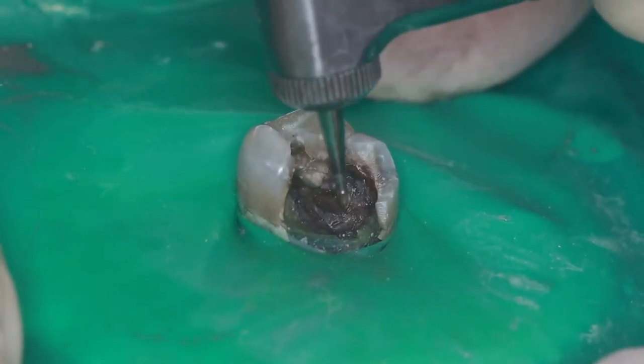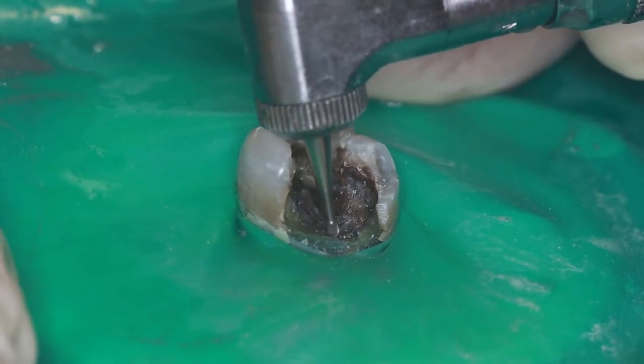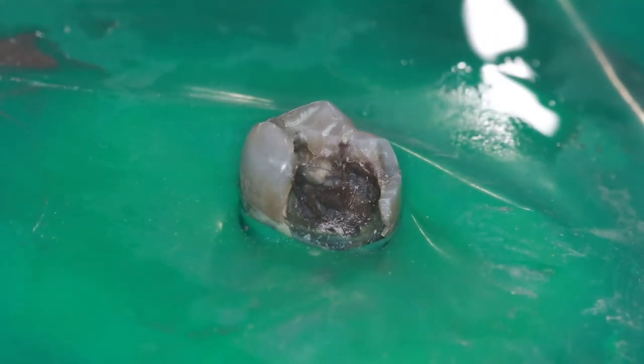The first step in placing a dental pin is placing a small pilot hole in the spot where you want the pin to go. This pilot hole is drilled with a small round burr in a slow speed handpiece and is used to keep the pin drill from moving around when it's in use.